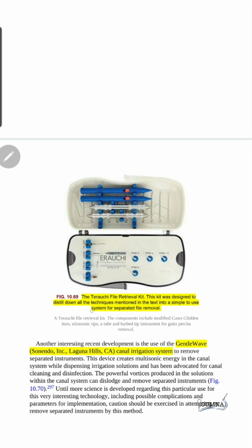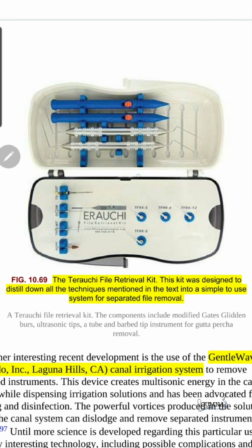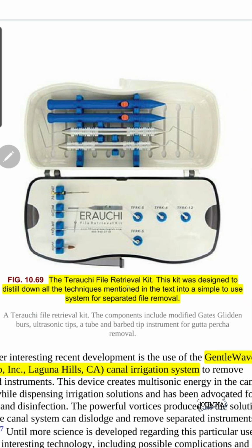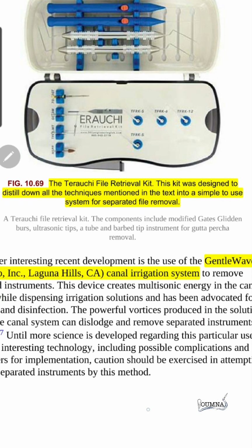For example, here the Terauchi file kit has been designed to cover all the techniques mentioned in the text. So we can see here the ultrasonic tips, the burrs, the Endo Explorer, the BTR pen.